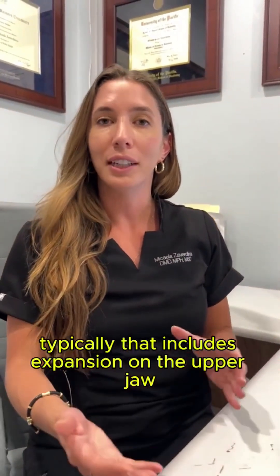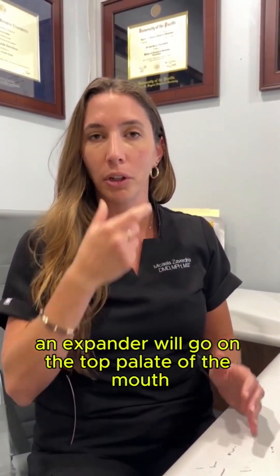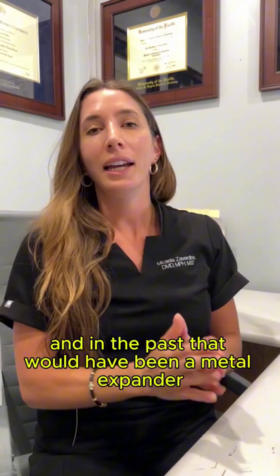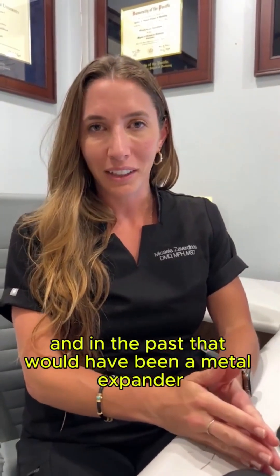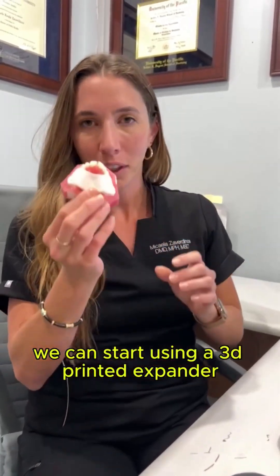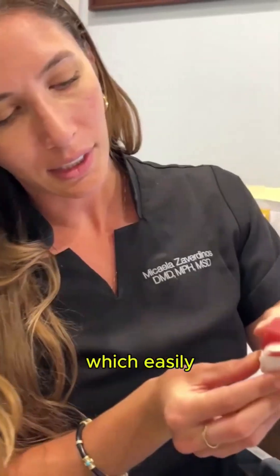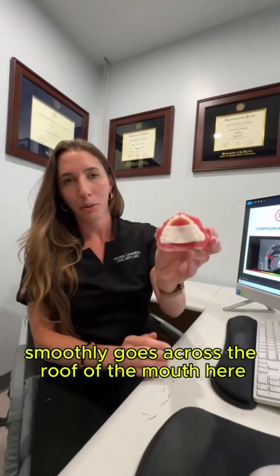Typically that includes expansion on the upper jaw, so usually an expander will go on the top palate of the mouth. In the past that would have been a metal expander, but we don't have to do metal anymore. We can start using a 3D printed expander — the Invisalign palatal expander — which easily and smoothly goes across the roof of the mouth.